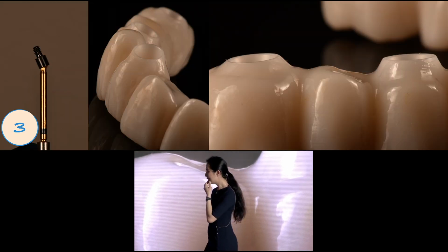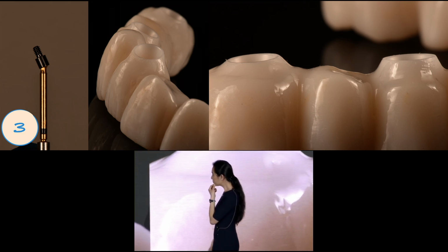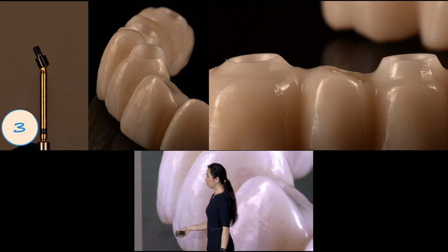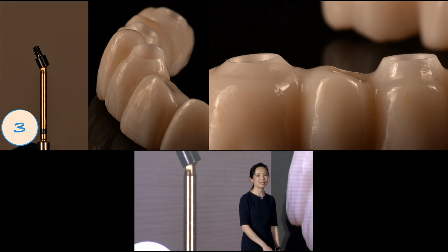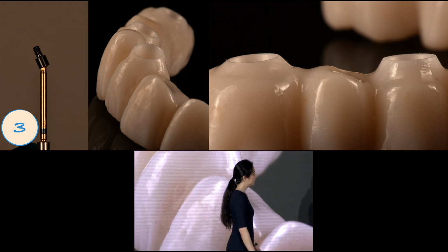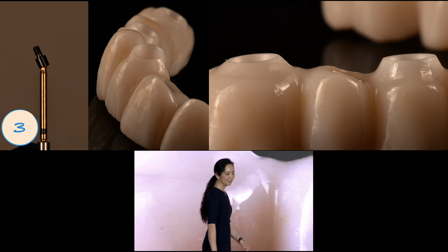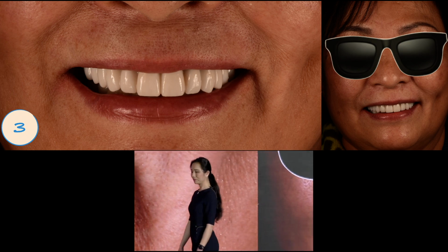Because look at this. This is what we received back in the mail. And what's nice is that for any areas where we had angulation issues, the new screw that comes with Procera frameworks actually allows us to compensate. But you can see the finish, you can see the intaglio surfaces, everything's really, really idealized. This is how the patient finished.